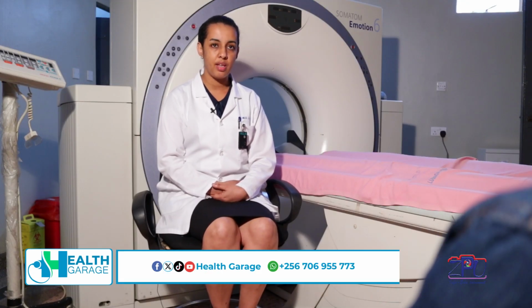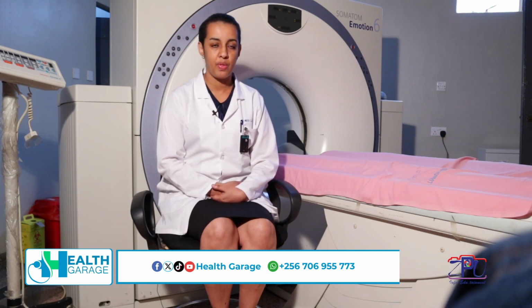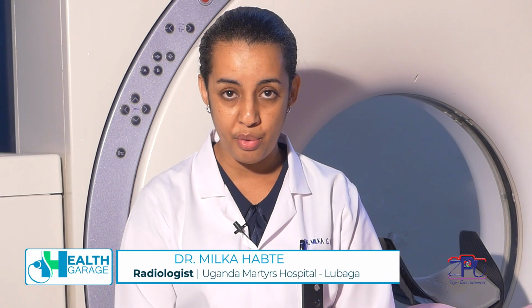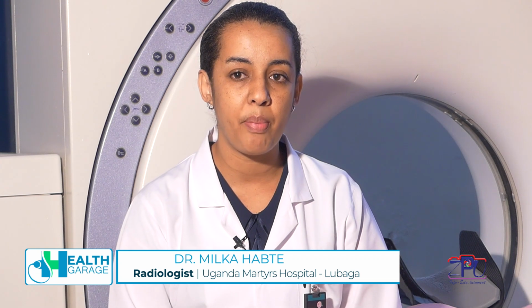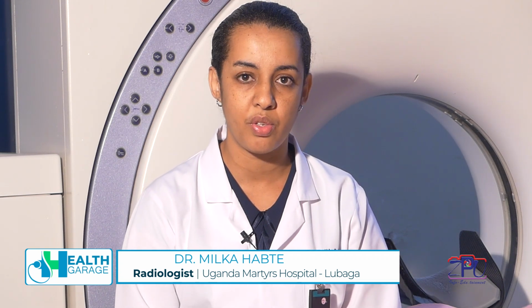It's a pharmaceutical substance which helps us make our images clearer. So we make sure that the patient is not allergic to that dye, or we call it contrast media. So before we go ahead and do the CT, there is a checklist we go through. We make sure the patient doesn't have a high risk of reacting to the contrast media.